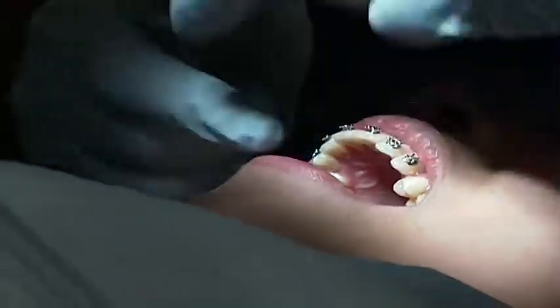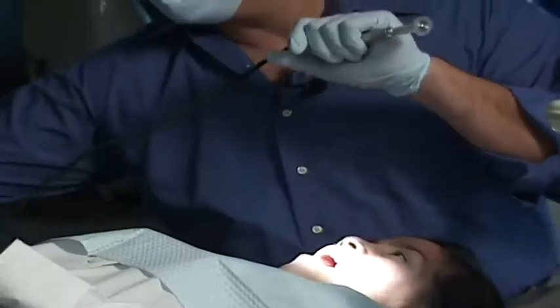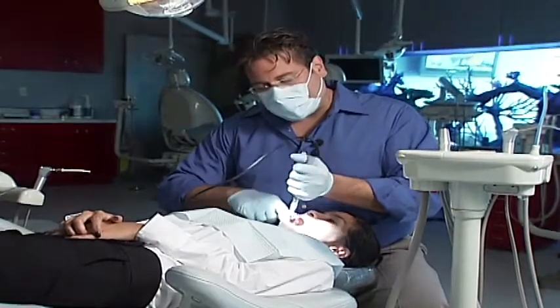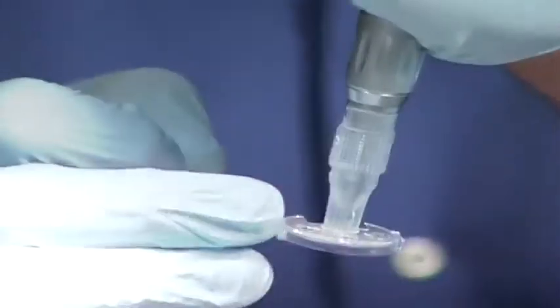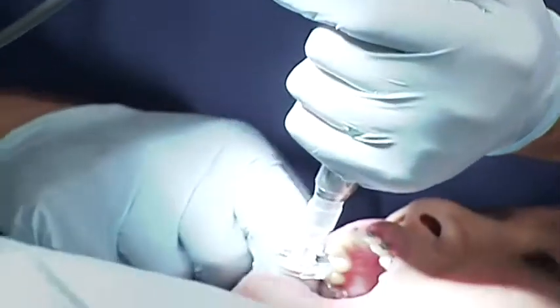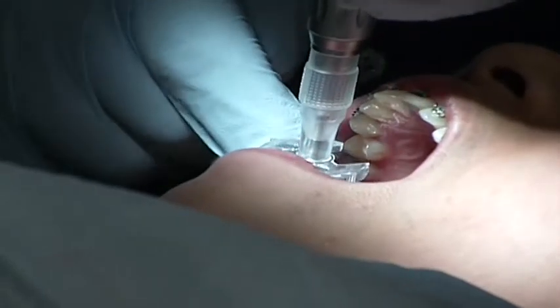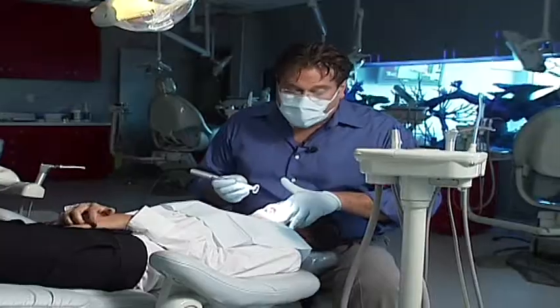When I switch over to the right side in the maxillary arch, I switch the handpiece into my other hand and hold it in this manner, retracting the cheek with the right hand, and I place my finger on the disc guard. The disc guard has a little notch to hold onto for control. Now I move through the upper maxillary right quadrant, performing interproximal reduction with control and safety.